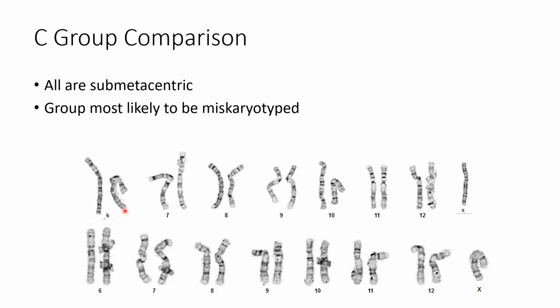Okay, so again, I think you can use this slide when you're beginning to mark your cases and do some karyotyping, to see the differences. We've talked about that light gap in 6P, the light in 7, but the distal end doesn't look the same.